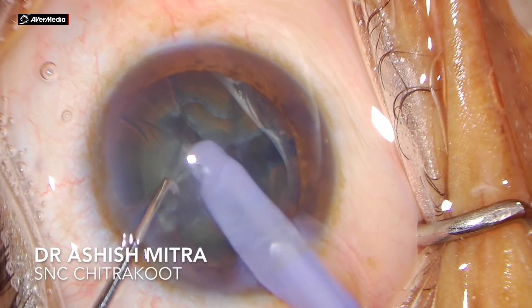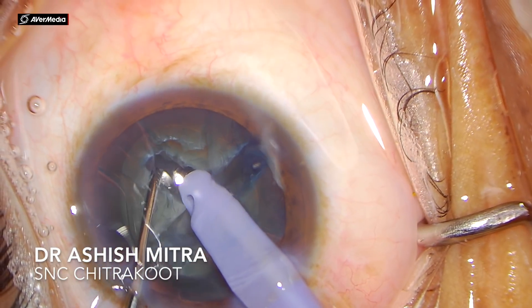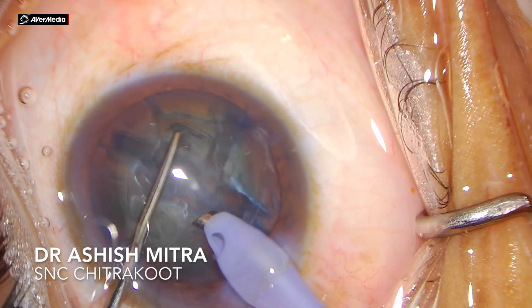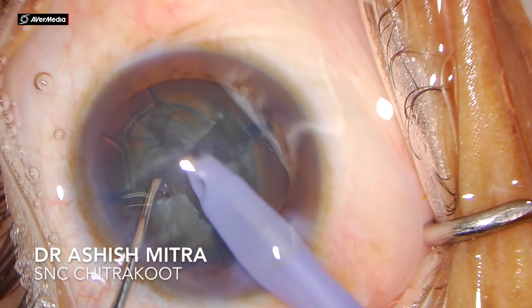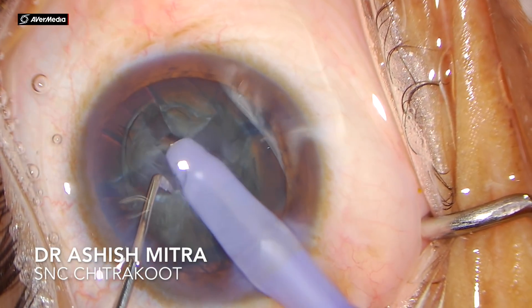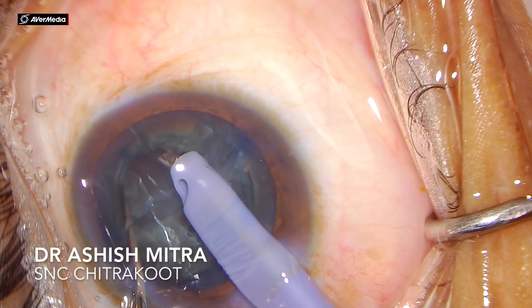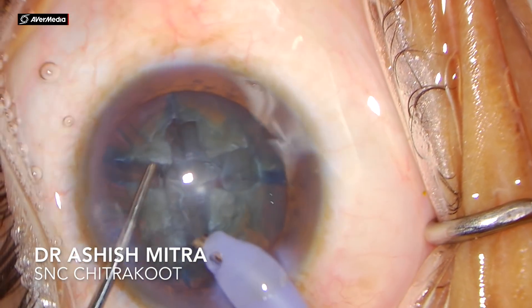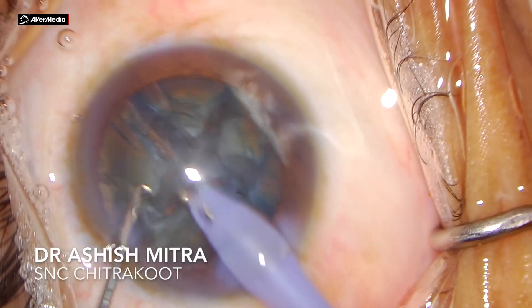Now you can see it was so easy to crack this nucleus into two. After rotating it almost 90 degrees, I made another trench in that half portion of the nucleus and divided it again. The other half is left and I am repeating this procedure again — making a small trench and then dividing it mechanically into two with the help of the chopper and phaco probe.